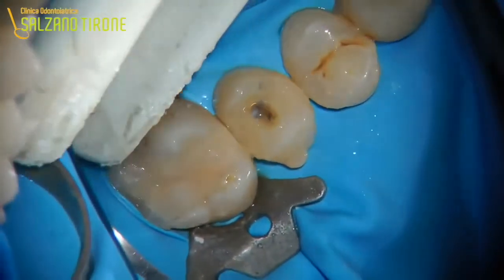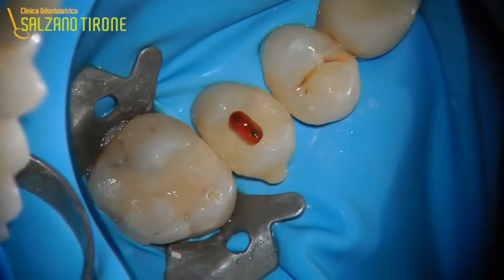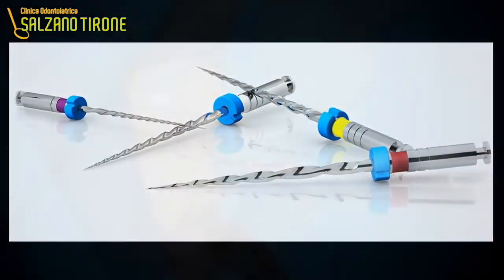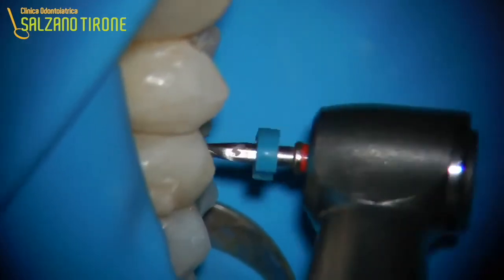Let's perform an access cavity as for an ordinary devitalization. Let's identify the two root canals, then you know how I typically use M2s. Let's carry out the root canal treatment. The apex locator works regularly. It generally doesn't go crazy when detecting granulation tissue.